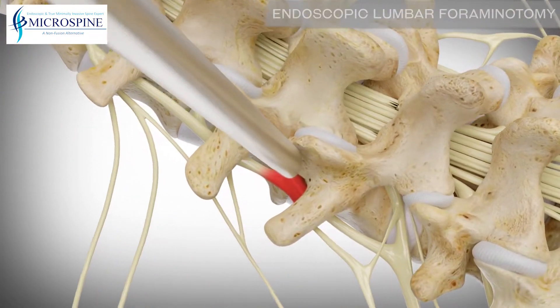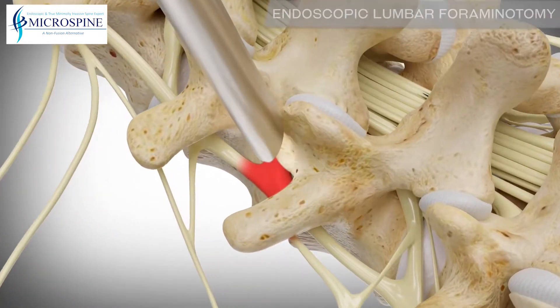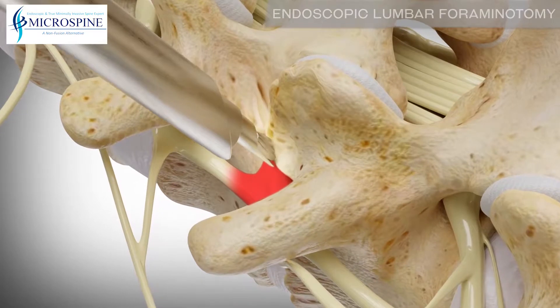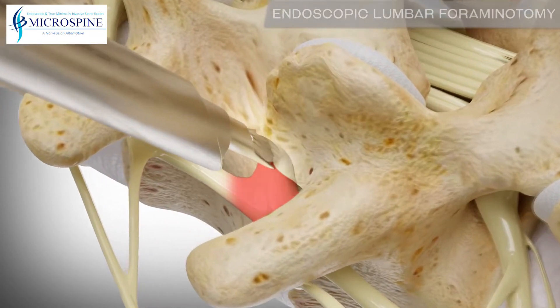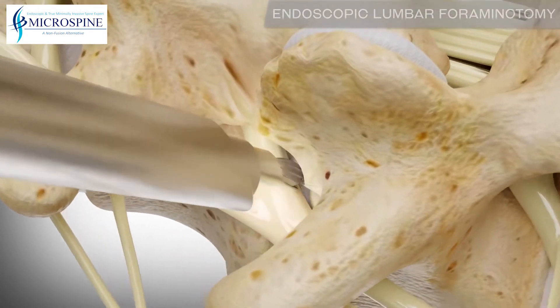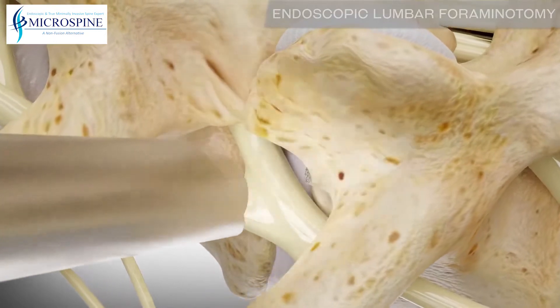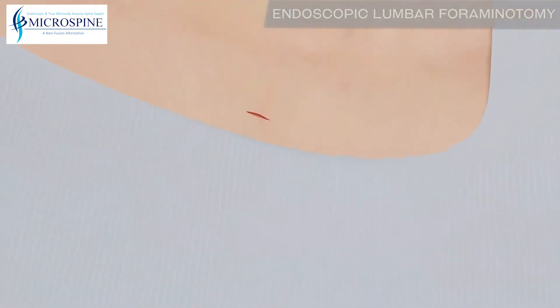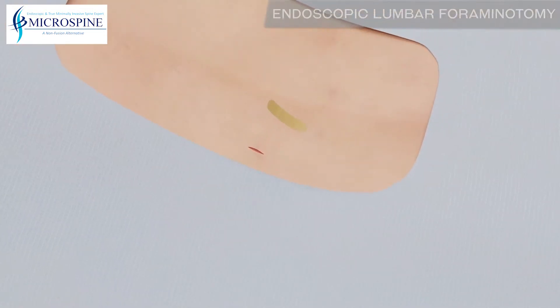A spinal endoscope and specially designed surgical instrumentation are used to remove the bone overgrowth, thereby relieving the pressure on the exiting nerve root. This procedure can be done through a single incision and closed with a small bandage.